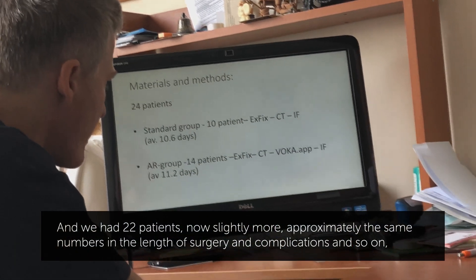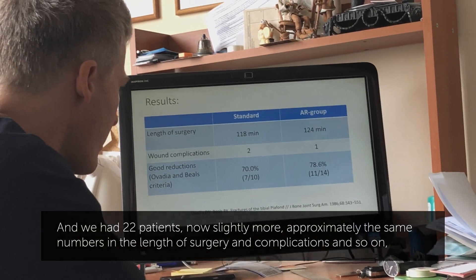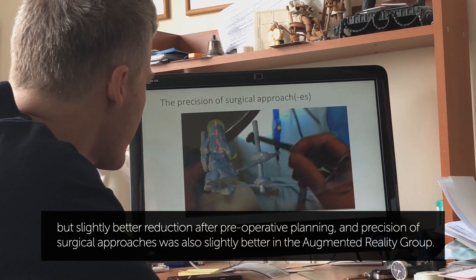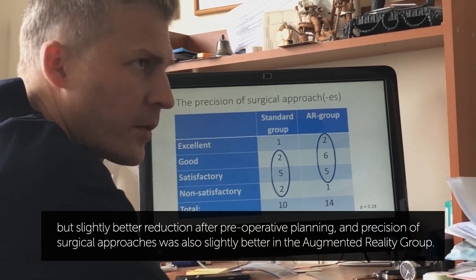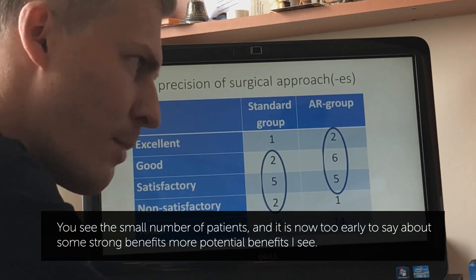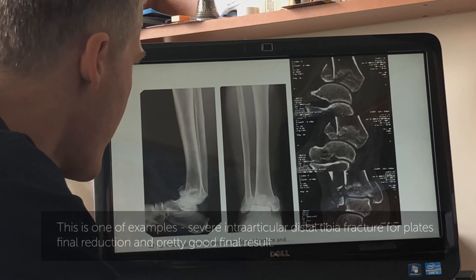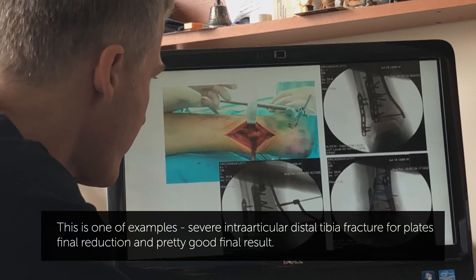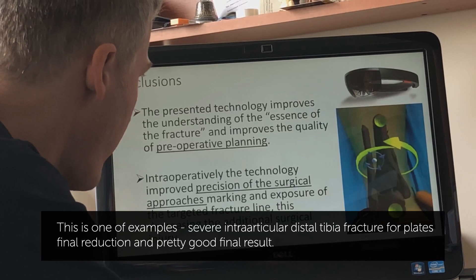We had 24 patients, now slightly more. The numbers are approximately the same regarding length of surgery and complications, but there is slightly better reduction after preoperative planning, and precision of surgical approaches was also slightly better in the augmented reality group. However, with a small number of patients, it is too early to claim strong benefits — more potential benefits, I see. Here is one example: a severe intra-articular distal tibia fracture, four plates, final reduction, and a pretty good final result.